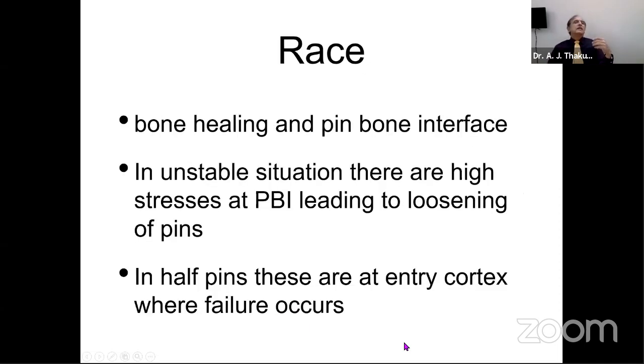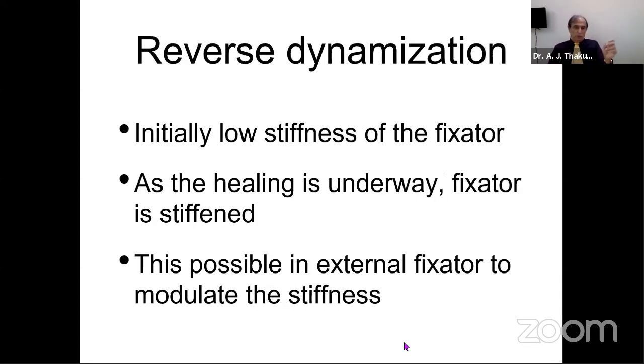This is all a process. This is a race between bone healing and the pin-bone interface. The sooner the callus formation occurs, the lesser is the load on the pin-bone interface, and longer is the survival of the fixator. So one should remember that the pins can fail at the pin-bone interface.